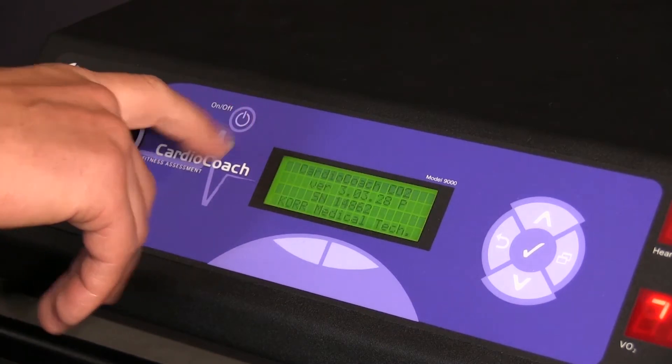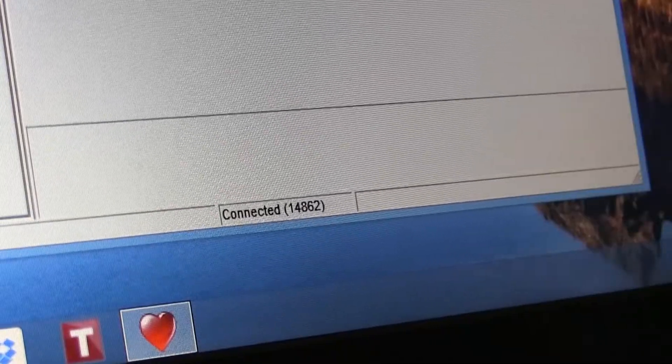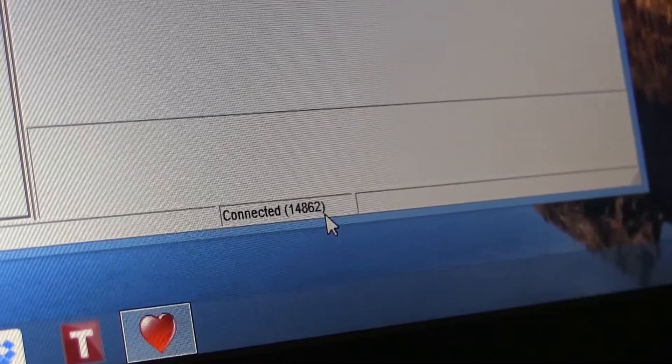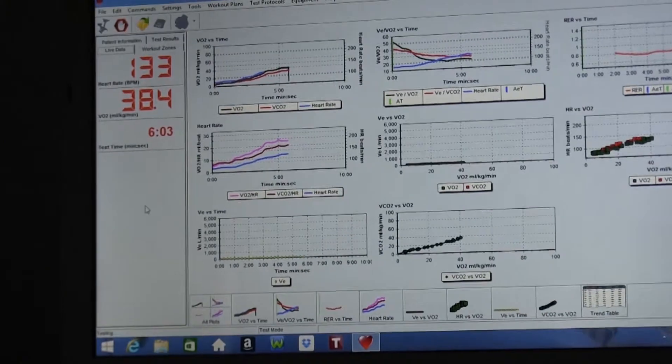As you start the software, make sure you power on your CardioCoach before double-clicking the heart icon. You'll know if your CardioCoach is connected to the software by looking at the bottom of the window. Take note that if you start a test from the CardioCoach unit and not from your computer, you will not be able to view the results until after the test is completed. Be sure to start your test from the monitor software so you can track the results in real time.